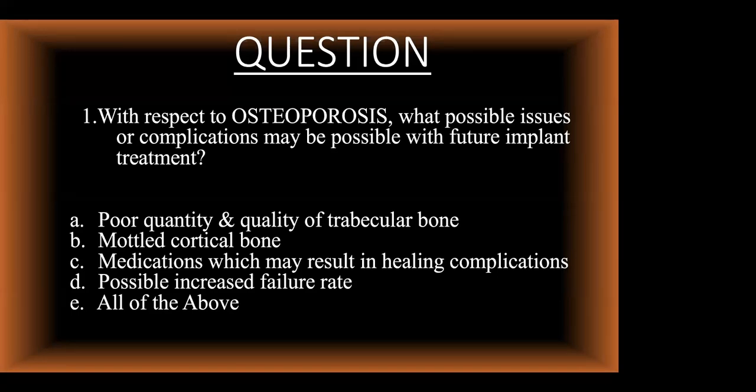So Robert, let's put up the question. Let's let our attendees answer. Let's see what our attendees get right here. Go ahead and answer A, B, C, D, or E. Robert will get a quick poll on that and we'll see what everyone answered.